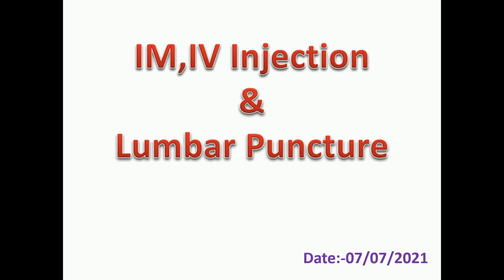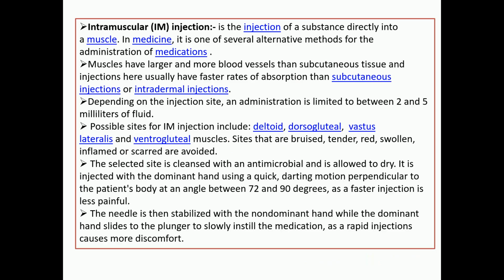Good morning, everyone. Today we discuss some clinical procedures used routinely for the administration of different medications. These are the intramuscular injection, intravenous injection, and lumbar puncture. First of all, we discuss the intramuscular injection: what are the steps and how we introduce the injection of any medication.